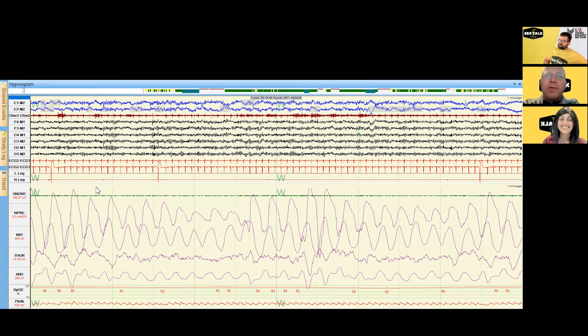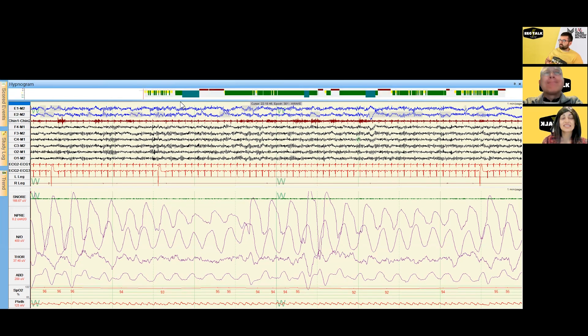Let's dive in. The hypnogram gives us a bird's-eye view of sleep stages across the night, running from lights out to lights on. Different colors represent different stages of sleep. You can see a lot of flipping back and forth between yellow and green — in our lab that's stage one versus stage two non-REM sleep — which indicates a lot of sleep fragmentation and instability going back and forth between those two stages.